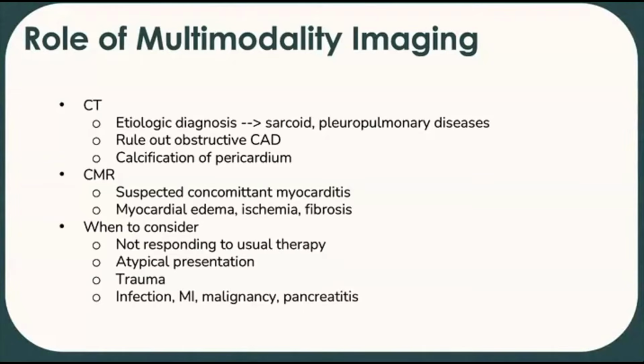So in patients with malignancy and suspected metastatic disease to the pericardium, you might see a smooth enhancing pericardium with very small effusions that would initially suggest just a non-malignant pericarditis, but diffuse tumor infiltration is also a possibility here, and so a CT or a PET might be indicated. And then in recurrent pericarditis, serial CMR exams can be used to follow pericardial inflammation during the treatment course to guide therapy. But this isn't really grounded in evidence. You'd need further studies to verify the actual benefits of this approach.